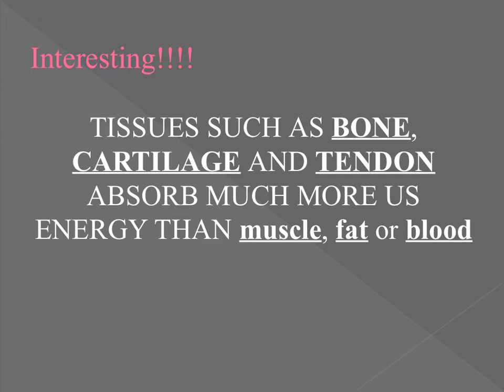Now, if your target tissue is the tendon, which most often in a patellar tendonitis and Achilles tendinopathy totally is, then we're in good shape, because what do we know about ultrasound? Tendons love to absorb, right? Now, cartilaginous structures are very hard to get at. If we're thinking like the meniscus in the knee, for example, first we have to get through the infrapatellar fat pad that sits between that meniscus and the epidermis, right? But certainly if it's a tendinous structure, ultrasound is a great tool to use, because a lot of that ultrasonic energy is going to be absorbed by the tendon.